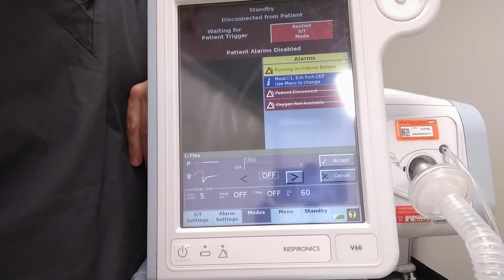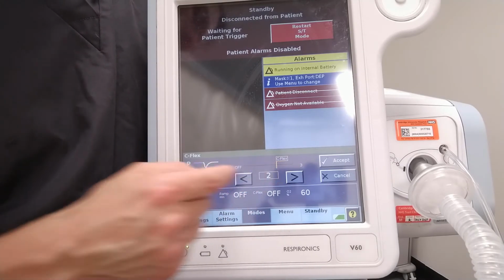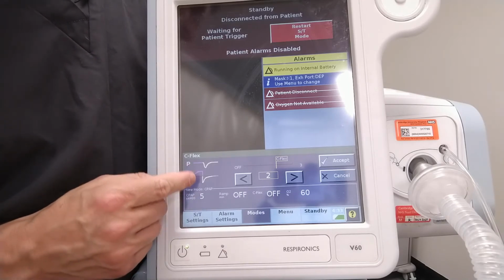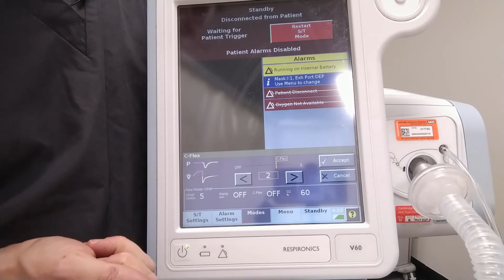C-Flex is a setting designed to help the patient who's finding it difficult to breathe out against the pressure the machine is delivering. What it does is it briefly drops the delivered pressure at the start of each exhalation the patient makes, and then restores it to the pressure that you set by the end of each exhalation.